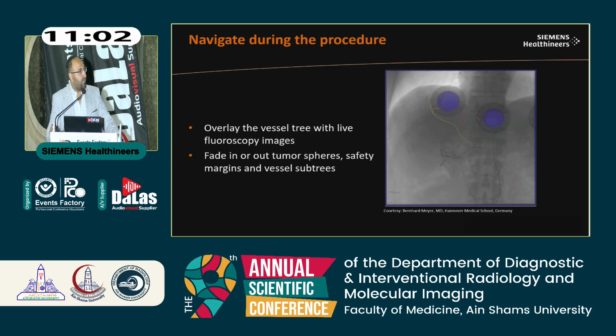And with the overlay function, we can use our diagram to navigate on the live fluoroscopy. So we can all the time see our tools while we are injecting, to make sure that we are in the right position and in the right branches.